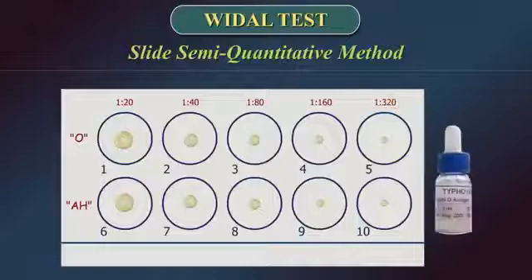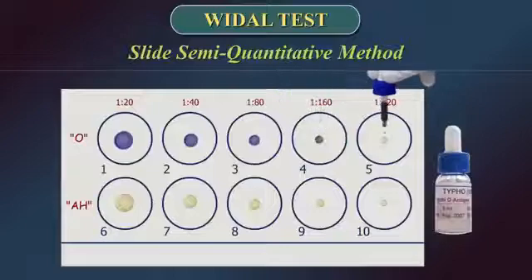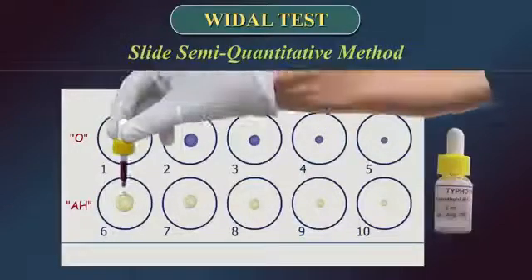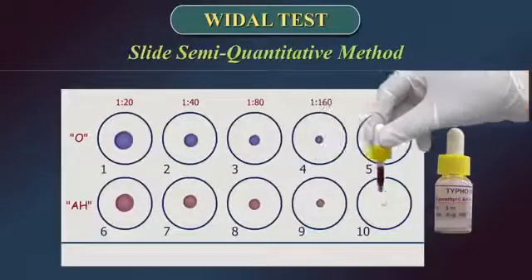Add to each reaction circle a drop of the antigen which showed agglutination with a test sample in the screening method. In our demonstration, it will be O and AH antigens.